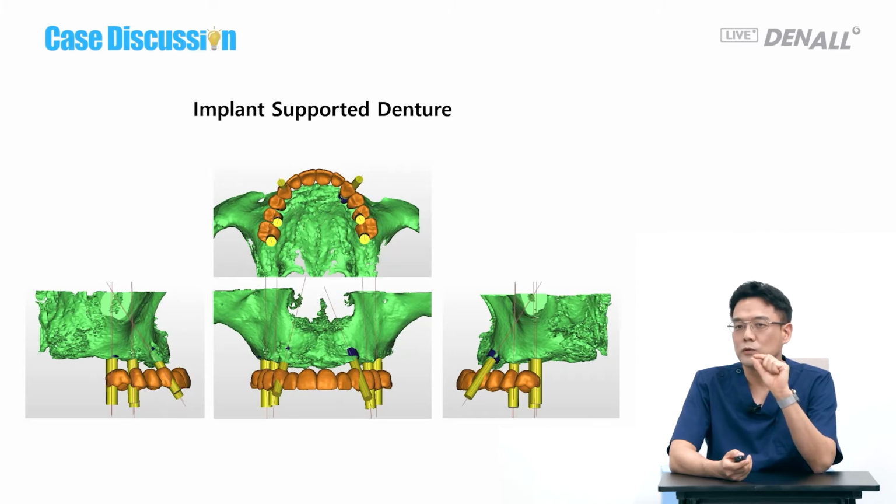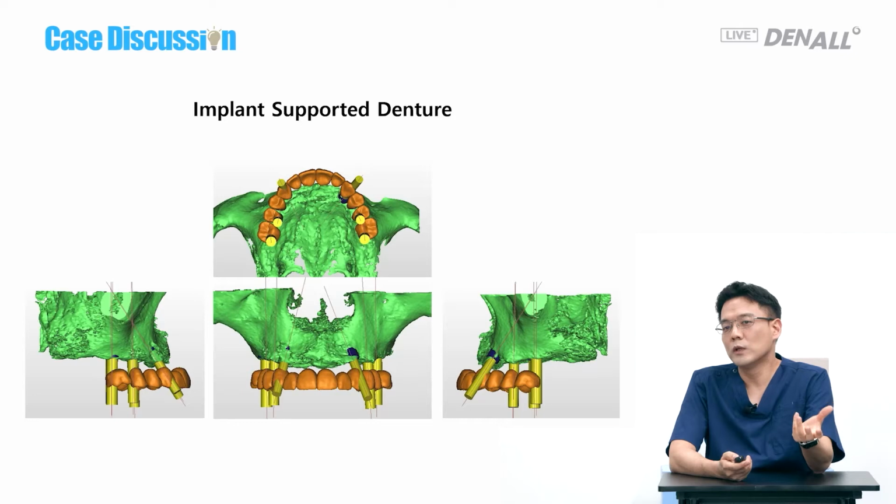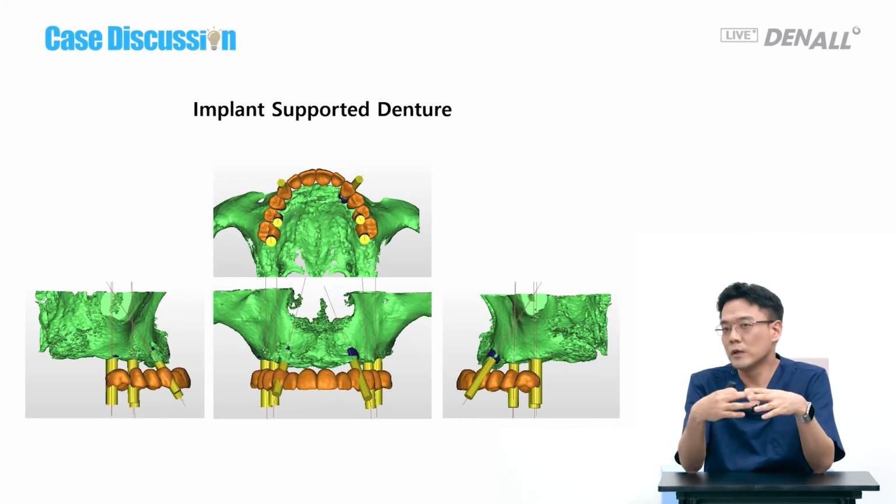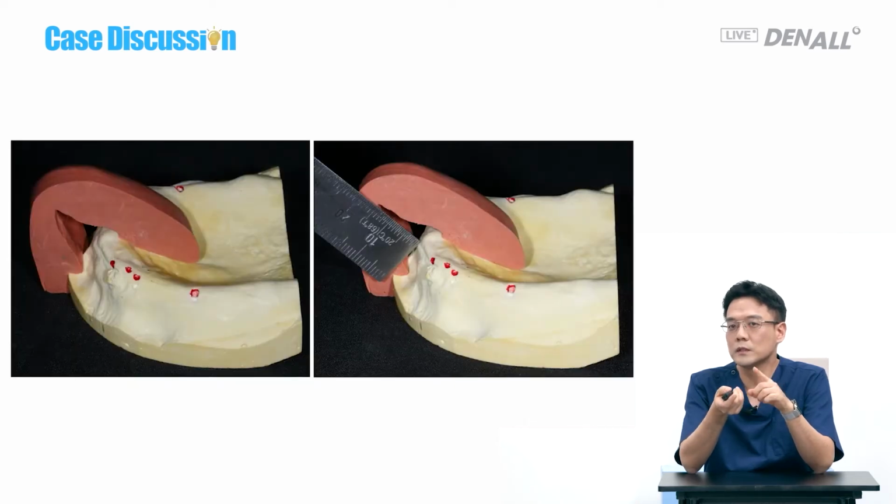if you take CT images and look at the dentition, there is a big gap between the lip support and the bone. We need to accommodate the request of the patient. We could remove the implants, or we can use the 13 and 23 that are remaining. We can do a GBR bone graft. So we can provide the fixed prosthesis.